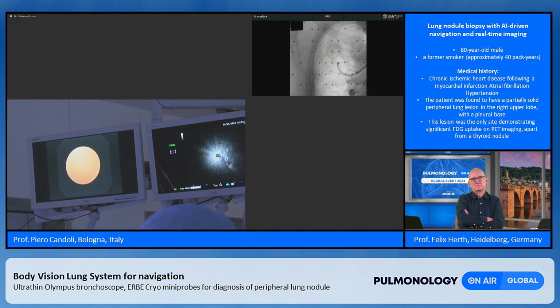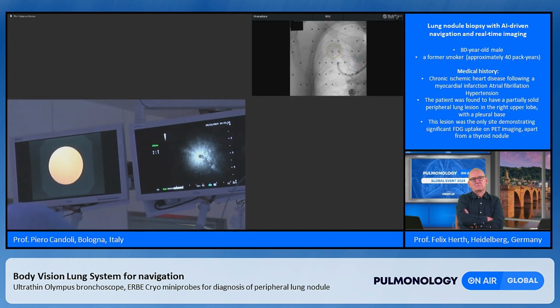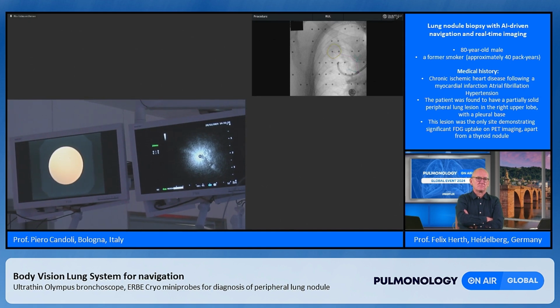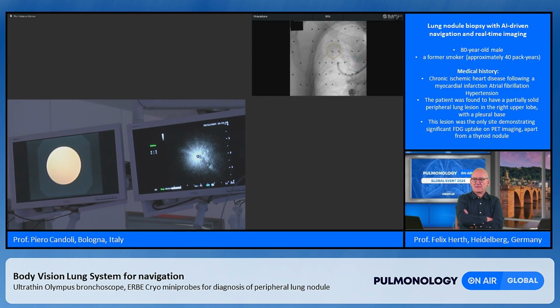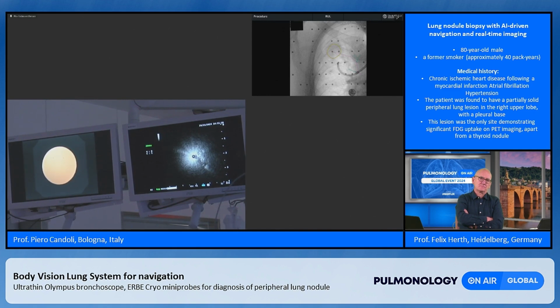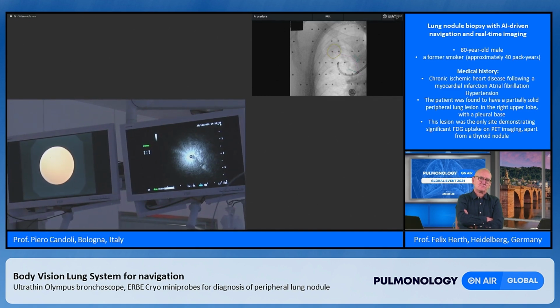Okay. We are forming the slide for the ROSE now at this moment. So, okay.